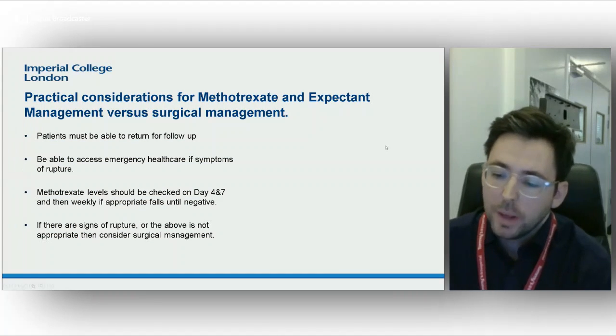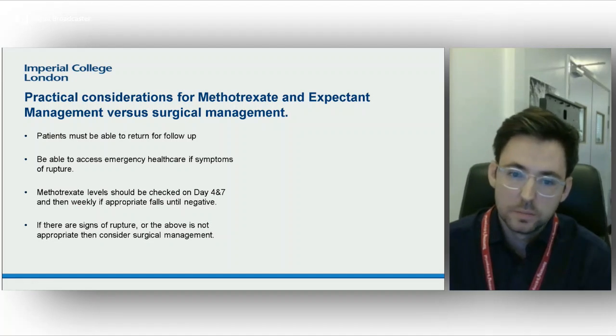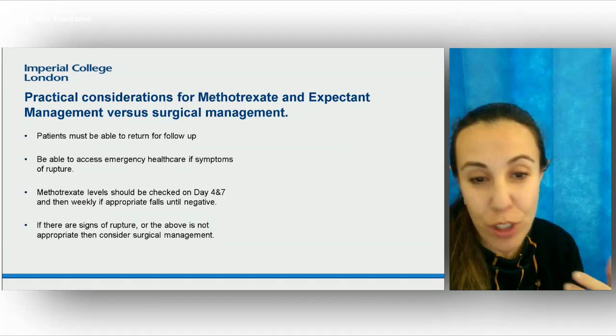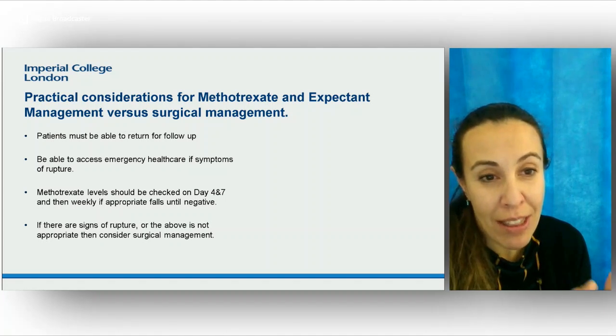Mayor, what do you think about the practical considerations for diagnosing and managing ectopic pregnancies in these settings? Well, Emma did a great summary, and like I said, there are so many factors to consider: the specific patient factors, the ultrasound factors, and also the local factors.